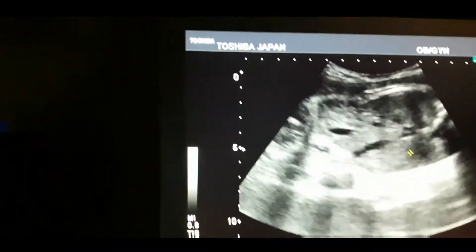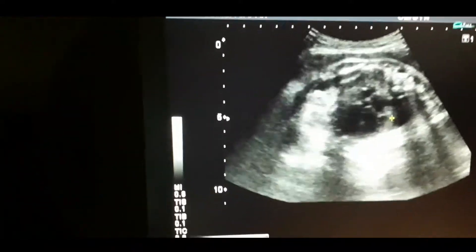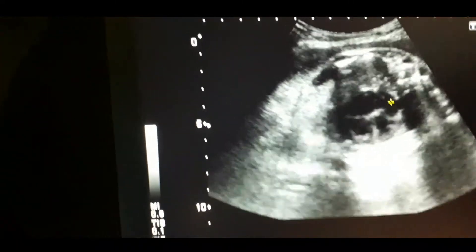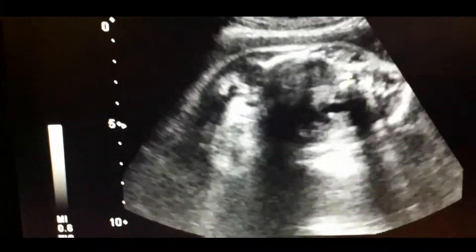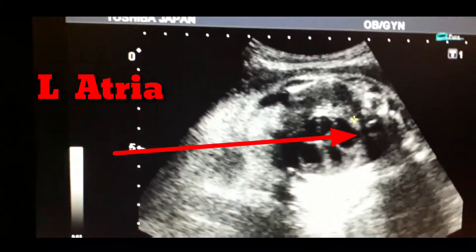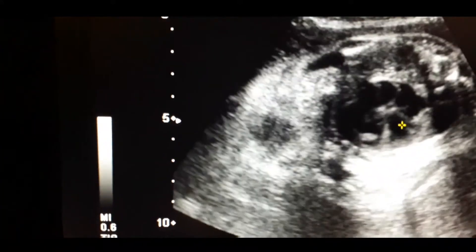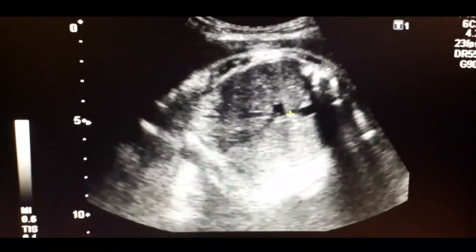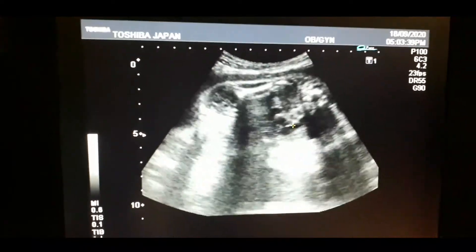The closest atria to the spine is the left atria. You can appreciate the spine closest to the left atria. There is also origin of the aorta visible here — you can appreciate the position of the aorta.